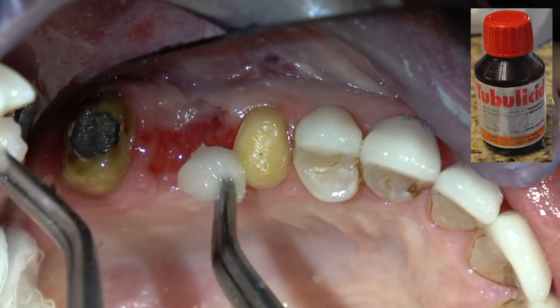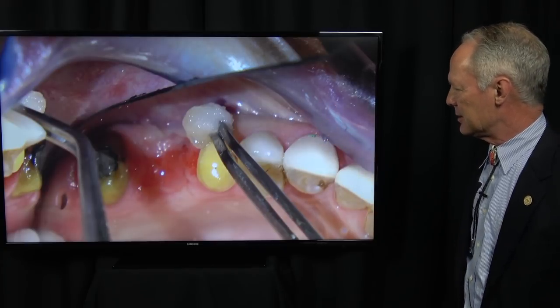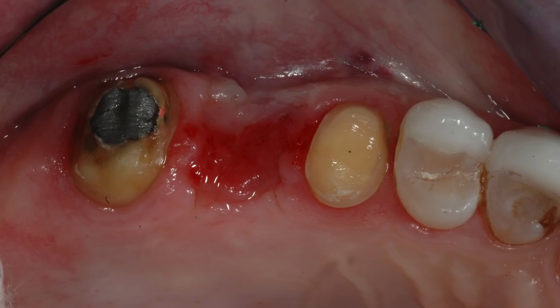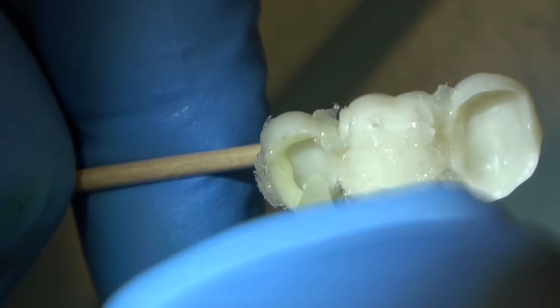I'm going to scrub the teeth with tubulicid red — this is just a cleaner and a desensitizer. Then I'm going to blot it dry with a 2×2, not dry it with air, before I cement the bridge. This is 3M Unicem composite resin cement.